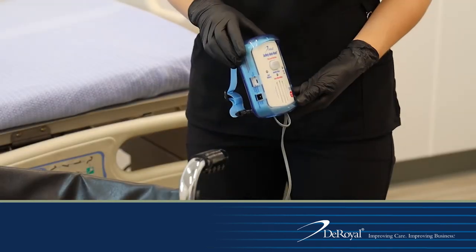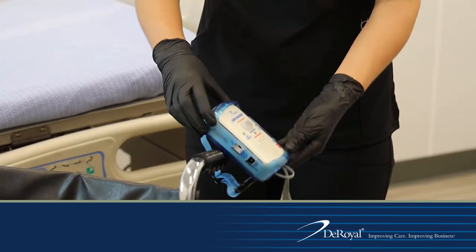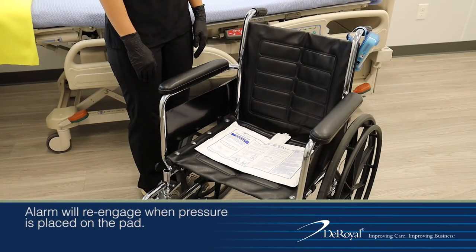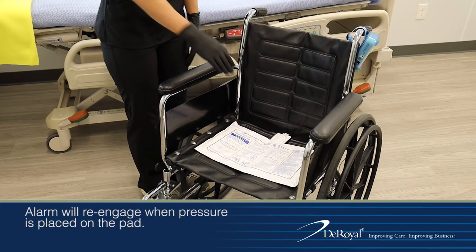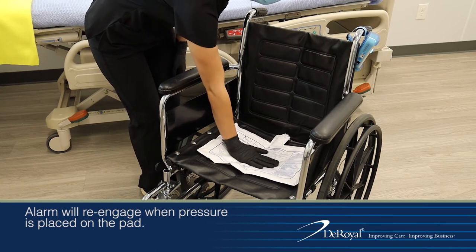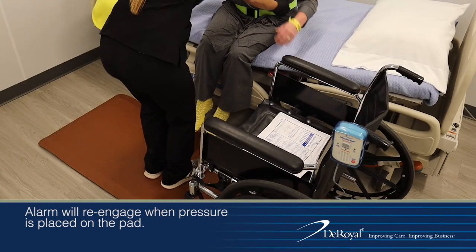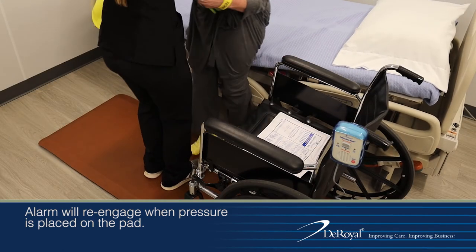When using the system with the wheelchair, place the monitor on the wheelchair seat back using the strap with buckle. Once the sensor pad is in place, test the system. Place pressure on the pad to activate the sensor pad. The monitor will beep two times to indicate that the sensor pad and fall monitor are in use. Help the patient into the wheelchair or recliner.